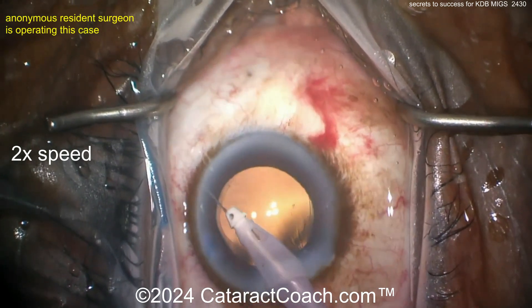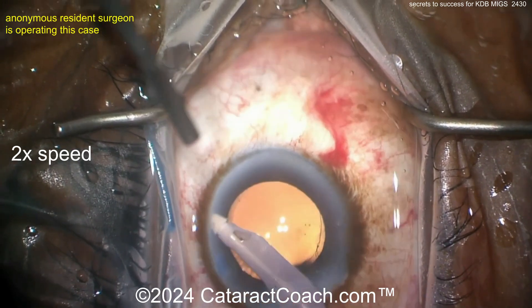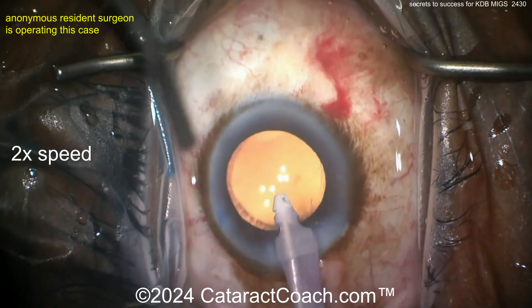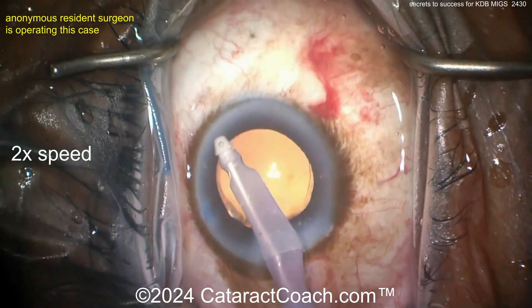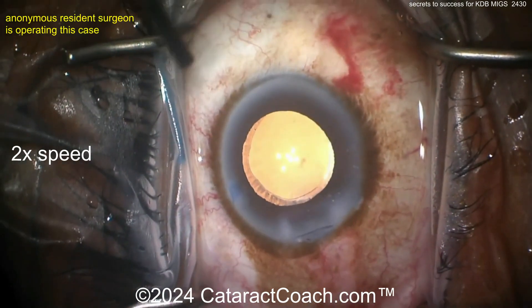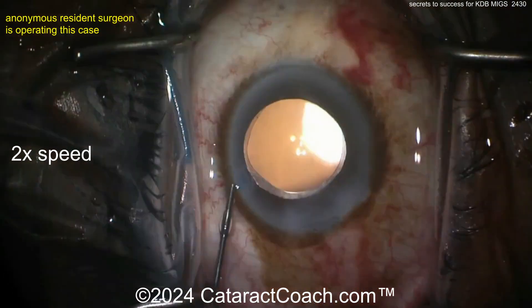Look at that — caught the trabecular meshwork strip there, and pulling it. Pull, pull, pull — it can be really nicely removed. You may need a little bit higher vacuum; keep your foot down on the pedal to make sure you get that. By stripping this away, you're ensuring you've done more than just make a cut — you're removing a margin of tissue so the ends can't go back together.